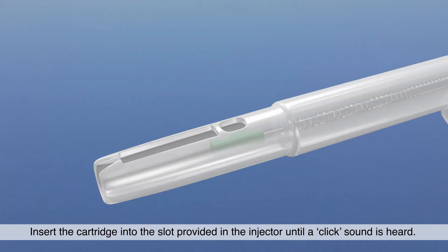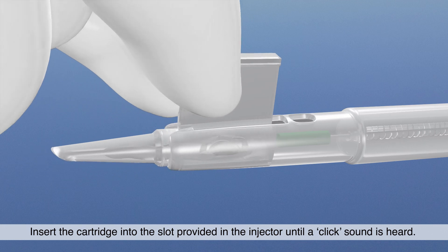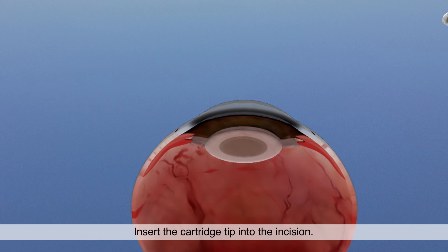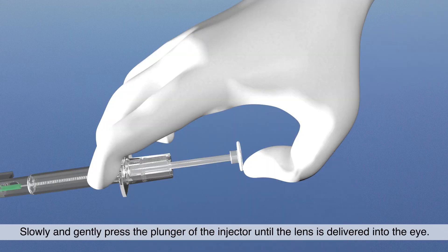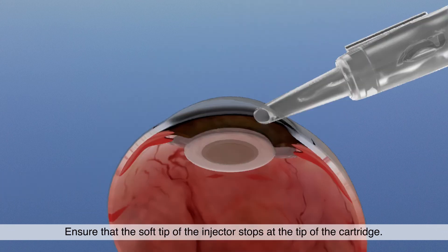Insert the cartridge into the slot provided in the injector until a click sound is heard. Insert the cartridge tip into the incision. Slowly and gently press the plunger of the injector until the lens is delivered into the eye. Ensure that the soft tip of the injector stops at the tip of the cartridge.